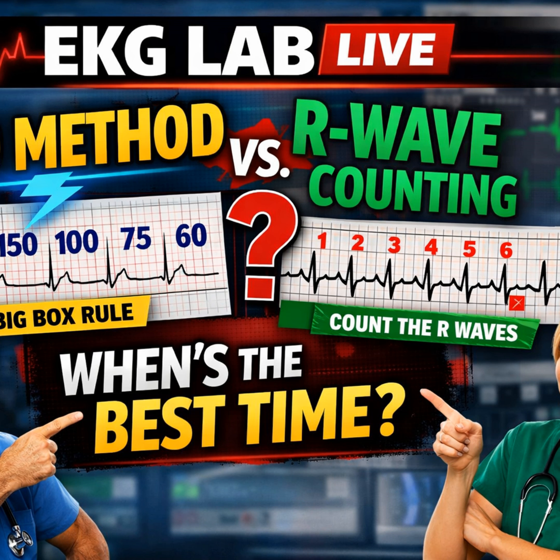This sequence, 300, 150, 100, it's not a guess. It is a mathematical derivation. When I use this, I'm getting the exact rate. And that is critical for telling different pathologies apart. Okay, give me an example where that specific number actually changes what you do. Look at the distinction between sinus tachycardia and supraventricular tachycardia, or SVT. The UNC source highlights this perfectly. A patient with sepsis might have sinus tach at 140 or 150. A patient with a reentry circuit, SVT, often hits 170, 180, or even higher.